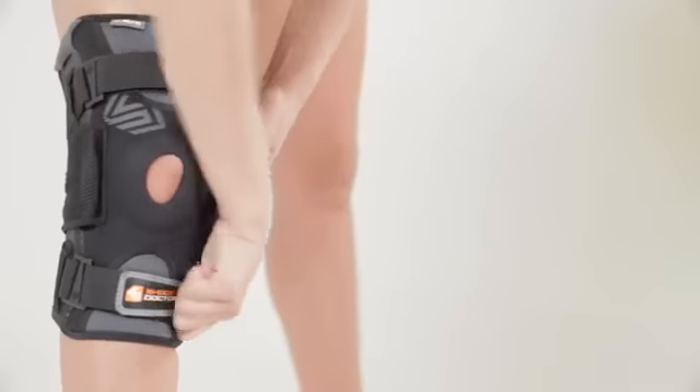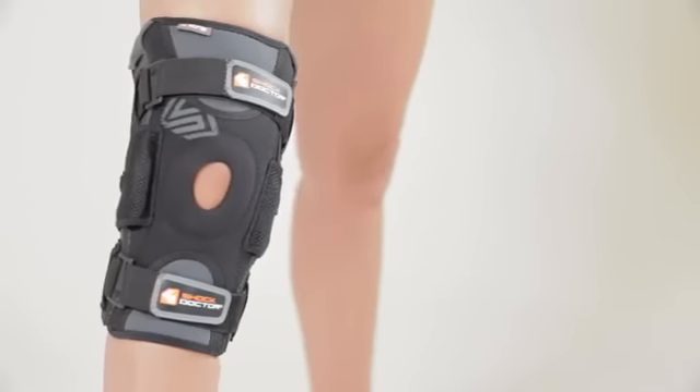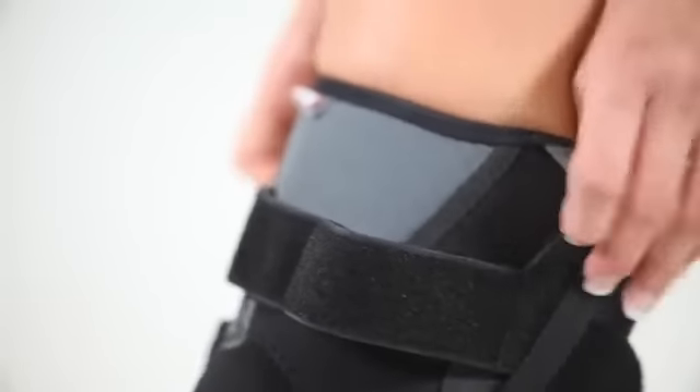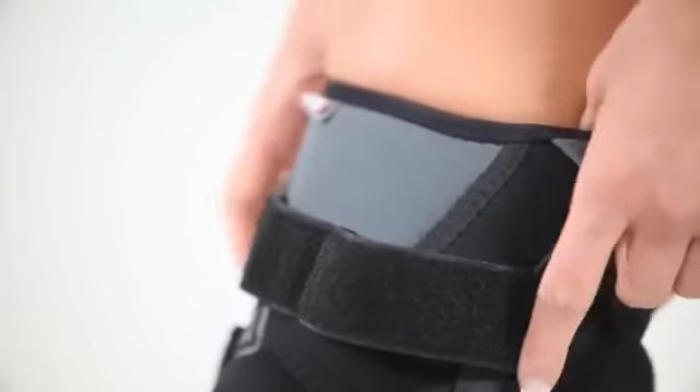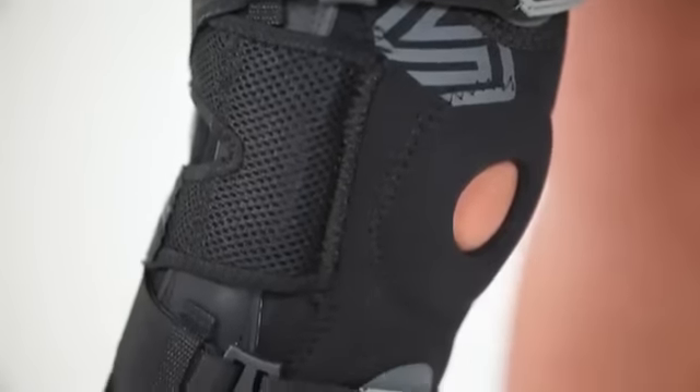Other features of the Ultra Knee Support include an anatomical pre-curve design, which provides enhanced fit, comfort, and stability performance. It also has convenient finger tabs to assist in putting the support on, premium stitching assembly, patella support finishing, and Lycra binding for long-lasting comfort.